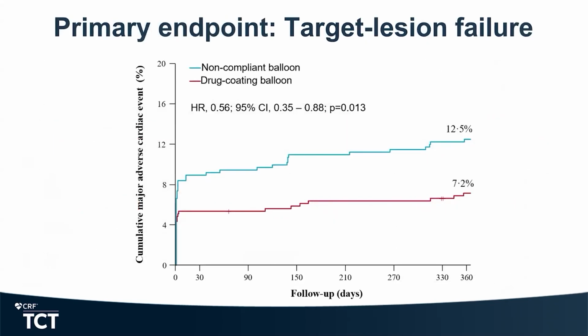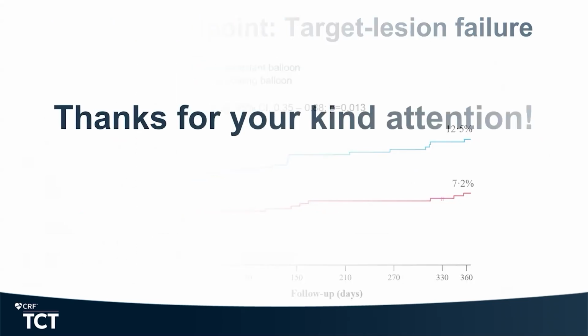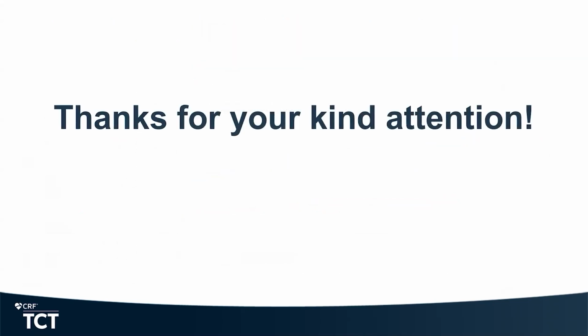This is the final Kaplan-Meier curve showing the significant difference in terms of the primary endpoint, target lesion failure. So this is the brief introduction of my trial. Thank you. Thank you so much.